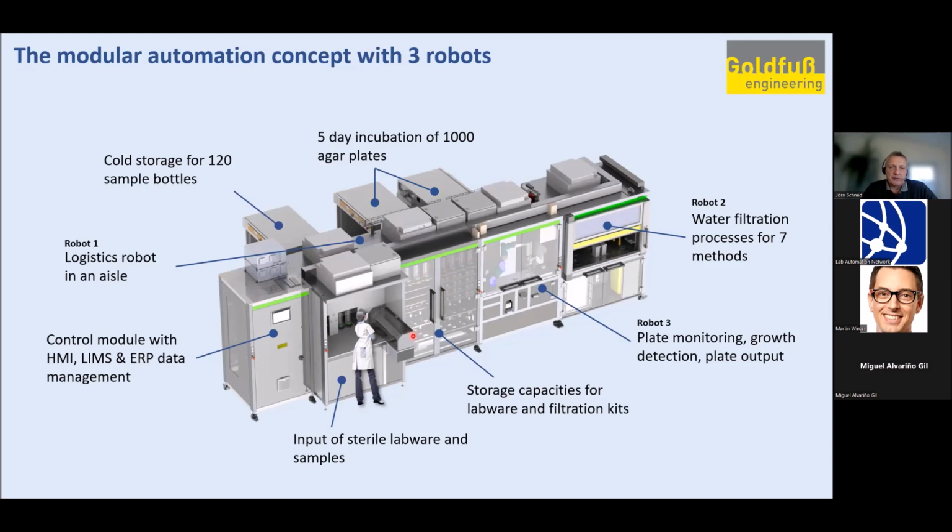From the front here, we have these big 2 doors for the storage module, these 2 windows here for the detection module, the electrical window for access to the workbench, and on the back, here's a big door from the back side, also to access the workbench.